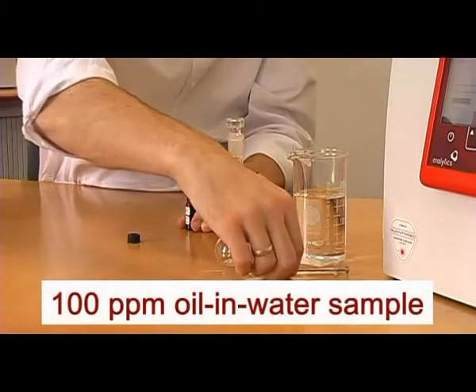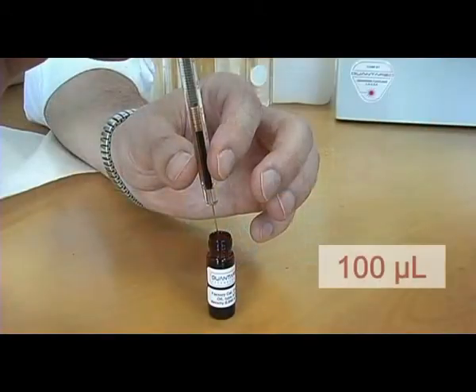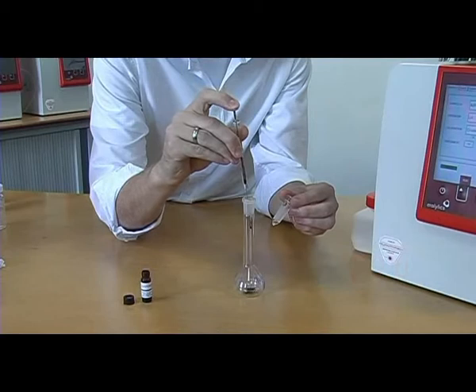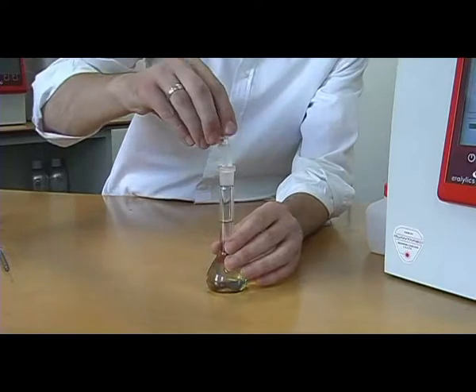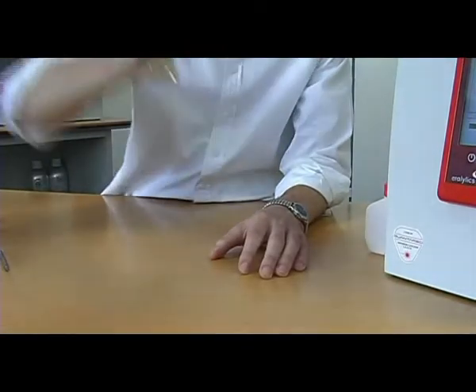The demonstration sample represents a 100 ppm oil-in-water sample after extraction. Use the microsyringe to transfer 100 microliters of oil into the volumetric flask. Fill up the flask to 50 milliliters with cyclohexane. Close the flask with the glass stopper and shake well. This preparation can also be performed in advance.